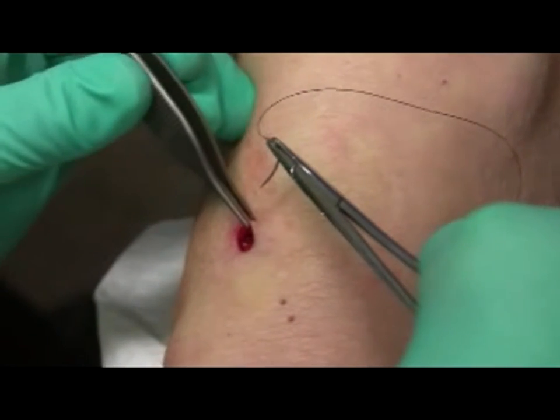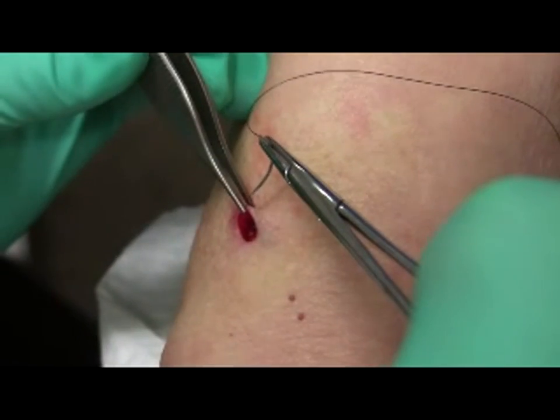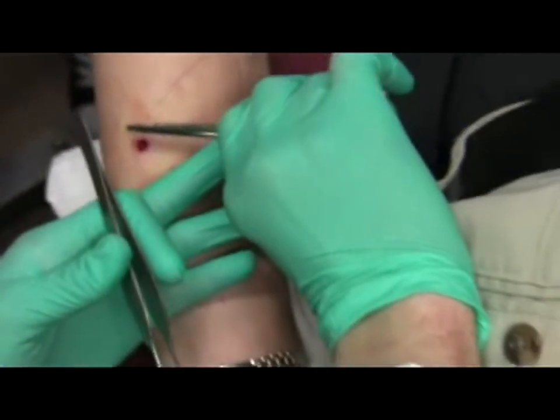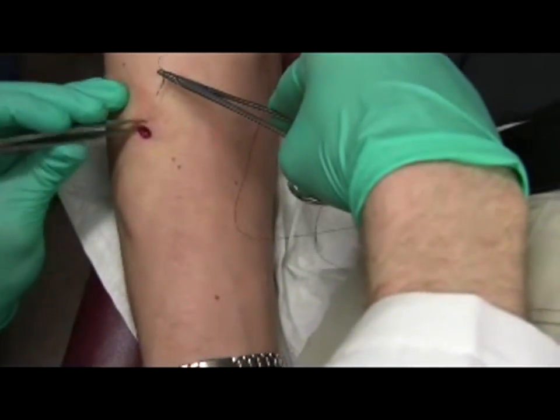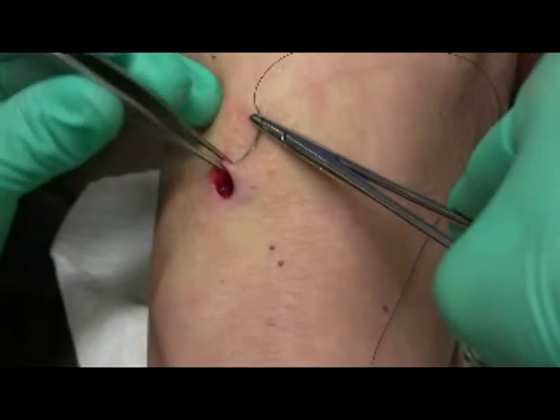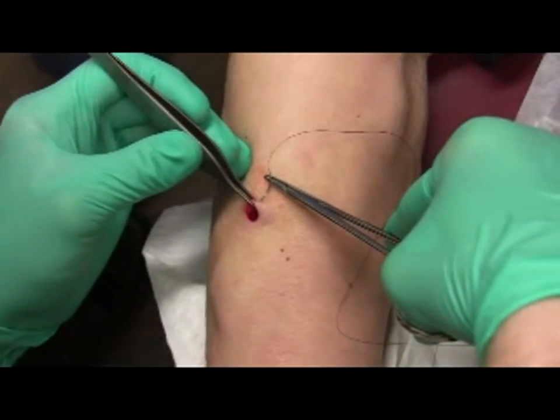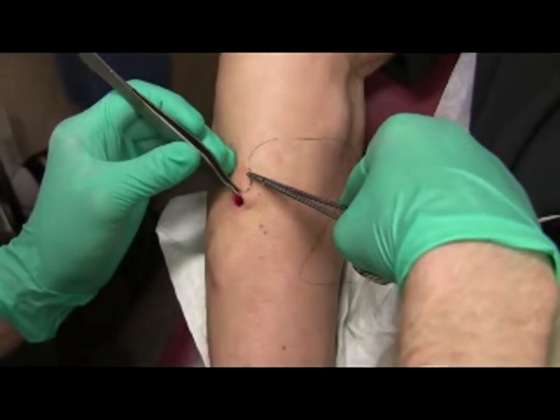Twist the wound edge towards the adjacent skin rather than toward the defect. Allow the needle to approach the skin perpendicularly. When you put a needle in, it wants to be perpendicular to the skin. The more natural position is where the needle faces toward me — so I just bend the skin up so now it's perpendicular that way. The preferred method is bringing the wound edge to the natural position of the needle, with palm facing the wound defect and hand perpendicular to the skin.